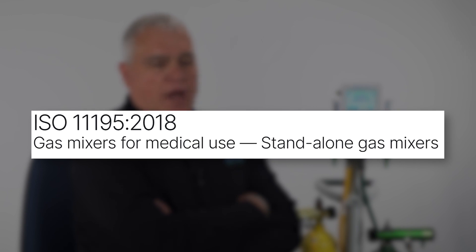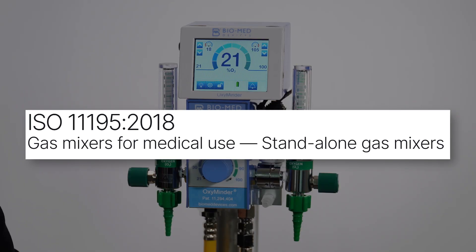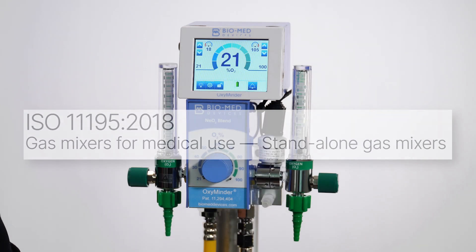Most people don't realize that every air oxygen blender manual states that according to ISO 11195, the blended gas is supposed to be analyzed before providing it to the patient.